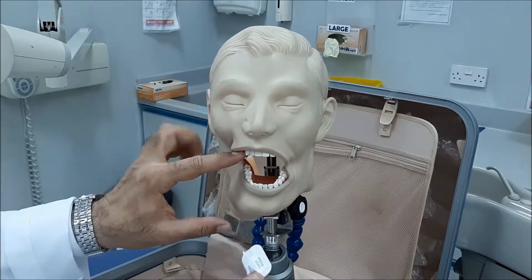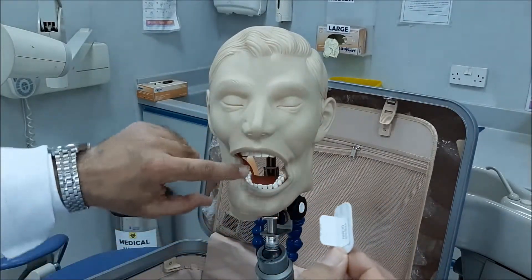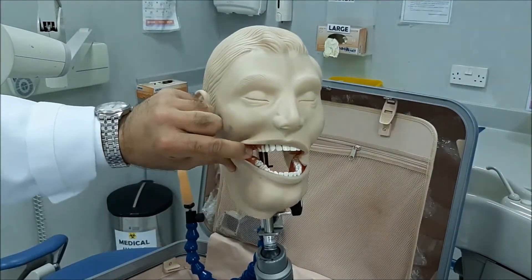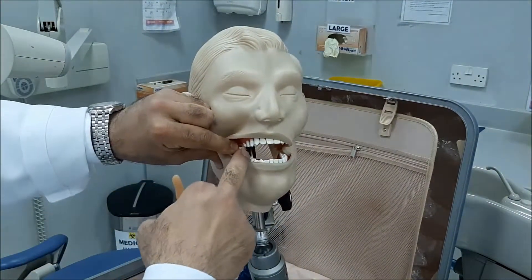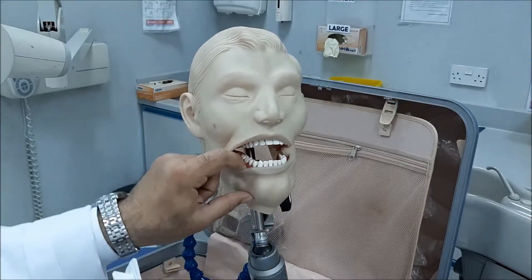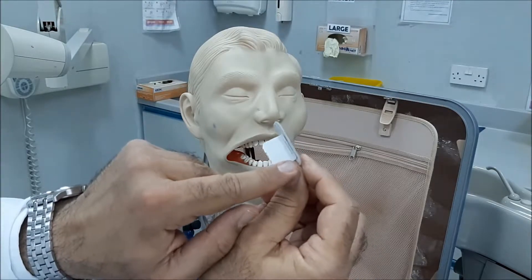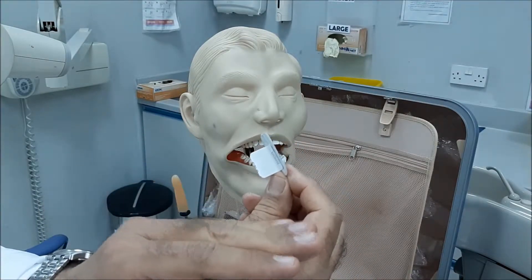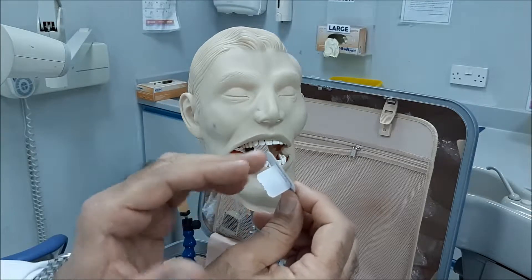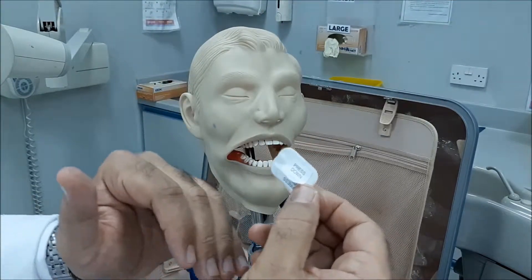When we did the pre-molars, the two pre-molars were biting on the tab. Now we will do the molars. When we do the molars, we will make the second molar — so this is the first pre-molar, second pre-molar, first molar — the second molar will be biting on the center of the tab, so that we guarantee the first molar and its mesial surface will show, and the third molar and its distal surface will show as well, for both the upper and lower teeth.